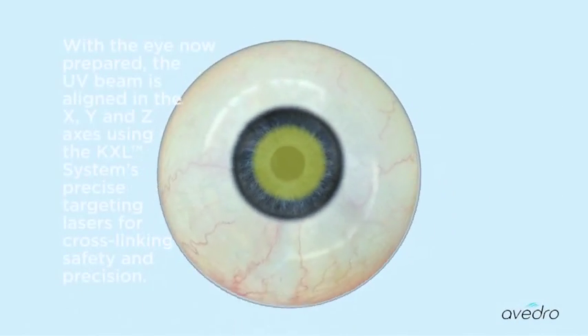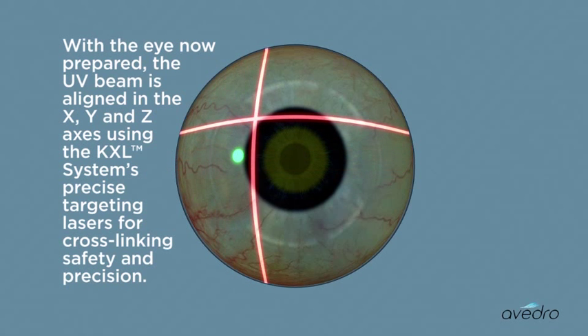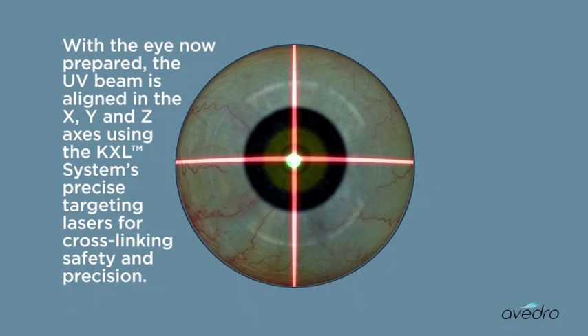With the eye now prepared, the UV beam is aligned in the X, Y, and Z axes using the KXL system's precise targeting lasers for cross-linking safety and precision.